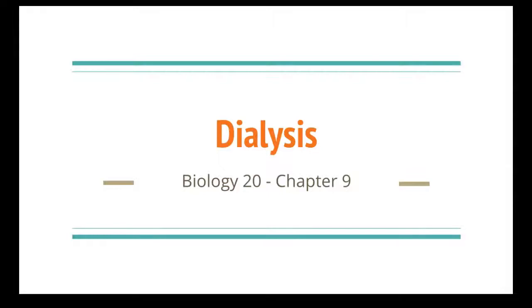In this video, we're going to be talking about what happens if your kidneys are not functioning properly. You can go through a process called dialysis. So there are two different types of dialysis. The very first one is called hemodialysis. Basically, you're using something called a dialysis machine, and you would be hooked up, and your blood would be taken from your body and put into the dialysis machine from an artery.